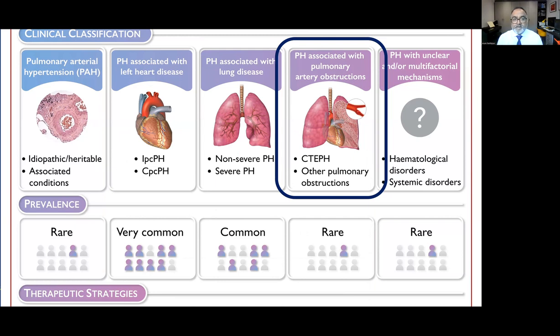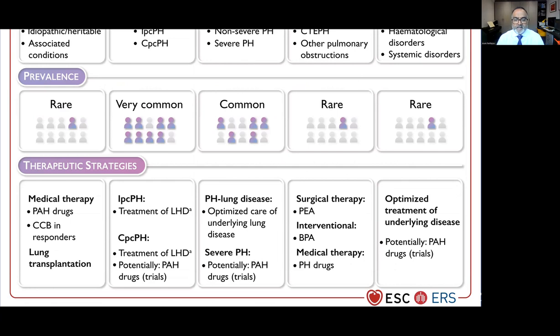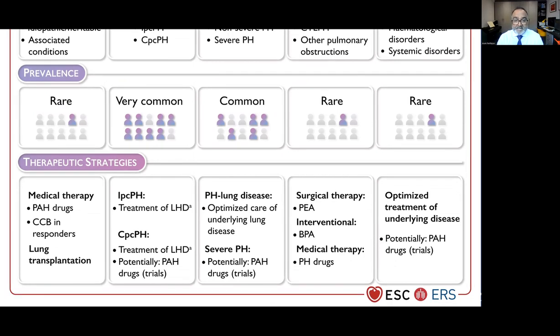The most common causes of pulmonary hypertension are heart disease and parenchymal lung disease. And our purpose of performing VQ scanning is to identify CTEPH. Now, why is that important? Well, the reason is because CTEPH is the only reversible or easily reversible cause for pulmonary hypertension. It is surgically treated, so we can do endarterectomy, we can do balloon angioplasty, and that's the reason we perform the VQ scan, is to identify CTEPH as a cause for pulmonary hypertension.